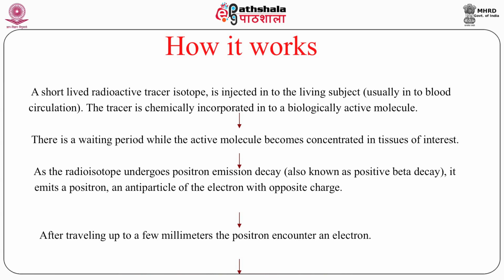Again, as I am telling you, what is fluorodeoxyglucose? It is a kind of glucose. It is labeled with an isotope, fluorine. Your cells which are very active and require energy for their work, which we do day in day out, need this glucose in order to be active.